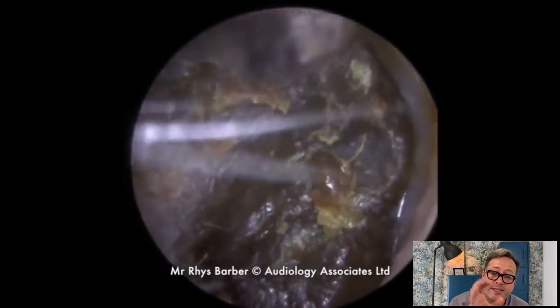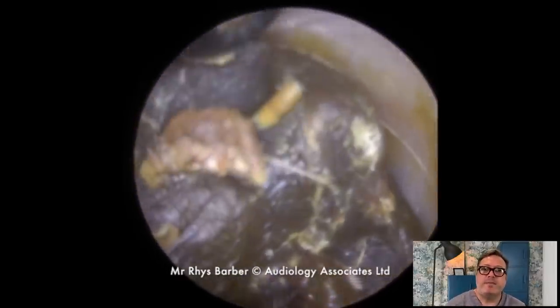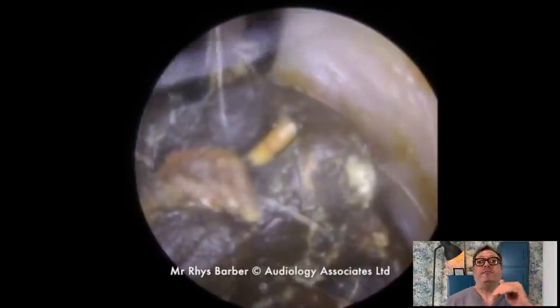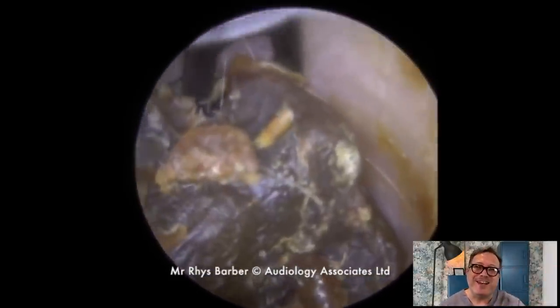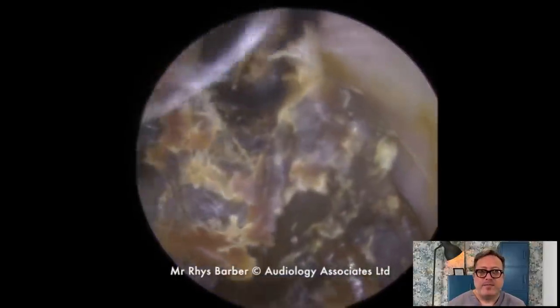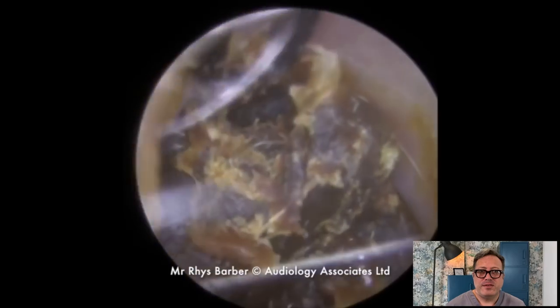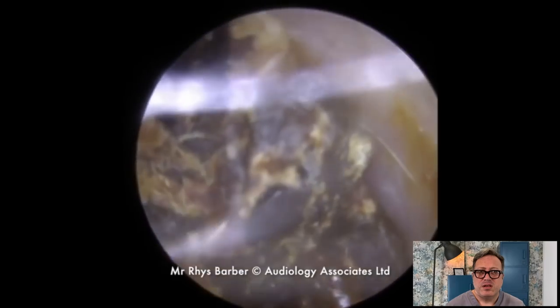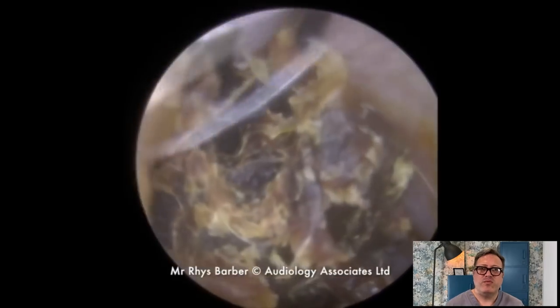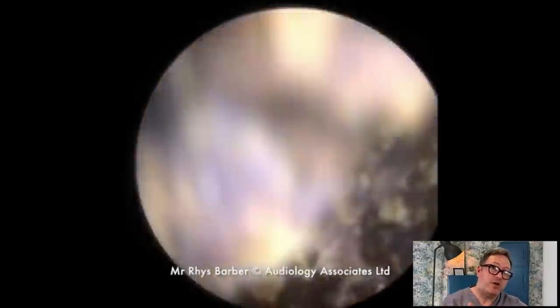This is the same patient but their second ear. Now we've got a really thick, hard lump of wax in here. I'm just trying to get above it with the jobson horn to pull that down and get rid of this. Slowly trying to rock this forwards — see how we're trying to roll it, but you can see how hard it is just by how the jobson horn flicks off the top.